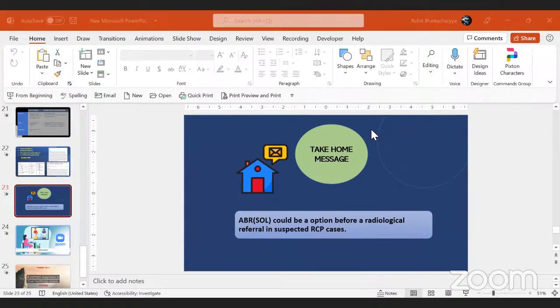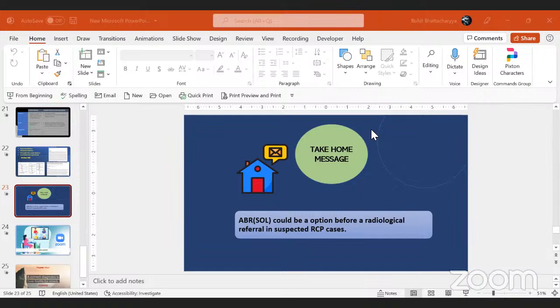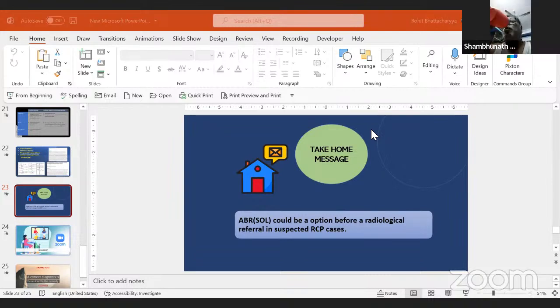Actually, you should continue with a series of different cases, particularly mixed hearing loss. That is the most confusing type. No one gets the answer. Rightly said, the audiologist should always have a discussion with the referring physician. That is most important. Otherwise, the physician becomes more confused, because they have a lot to do and the patient's expectation is more. And what treatment? That is very important. Only giving a report is nothing; giving a treatment, giving a judgment, giving a good solution and good counseling is important. Correct.